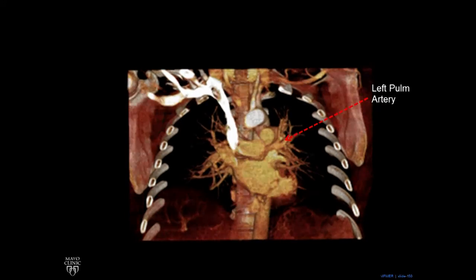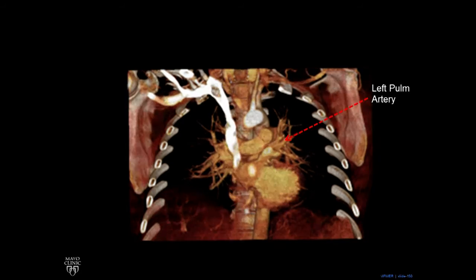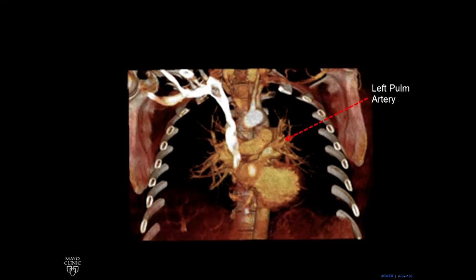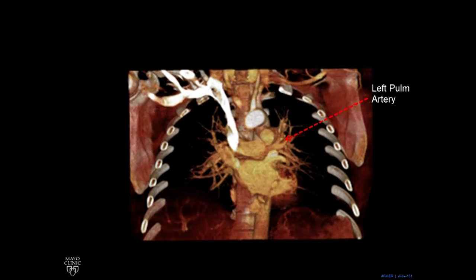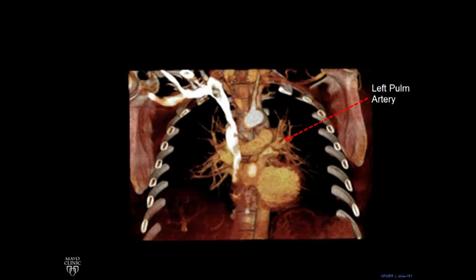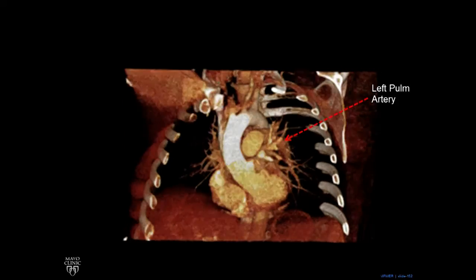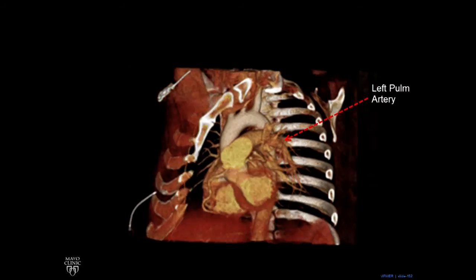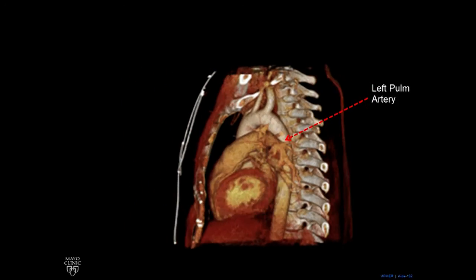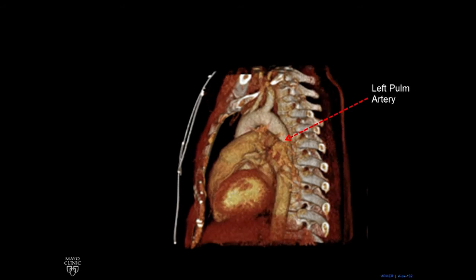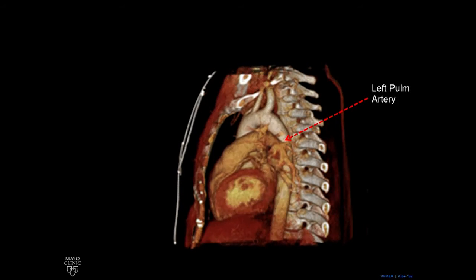We've cut away a little bit — you can see the right pulmonary artery running right to left, right behind the superior vena cava. The left pulmonary artery is running sort of front to back, harder to see there until we rotate it. As we rotate, you can see the left pulmonary artery running front to back, almost paralleling the aortic arch, but a little more inferiorly.